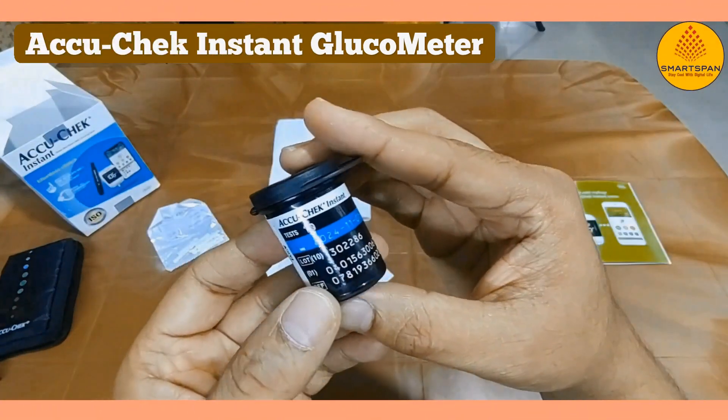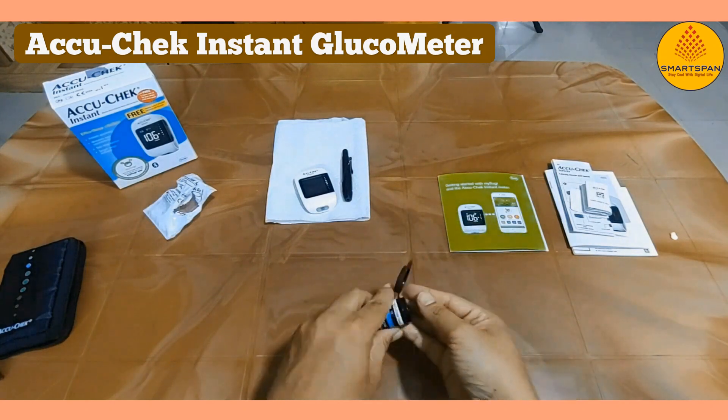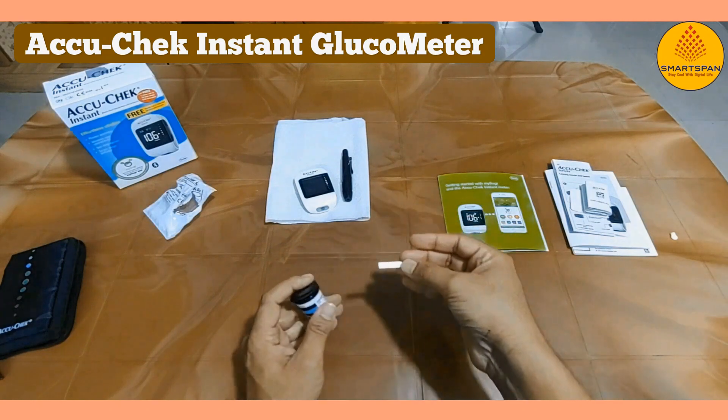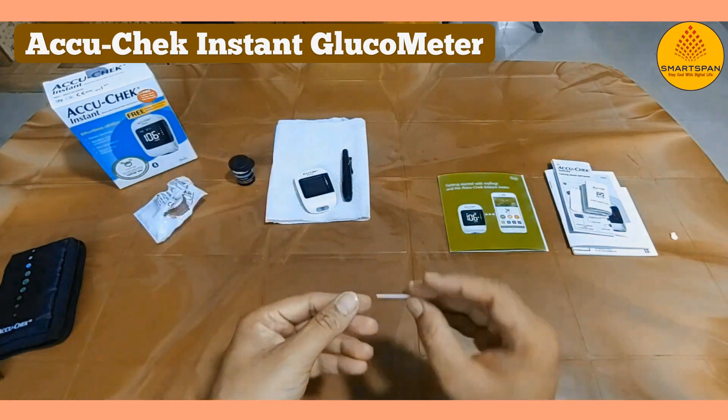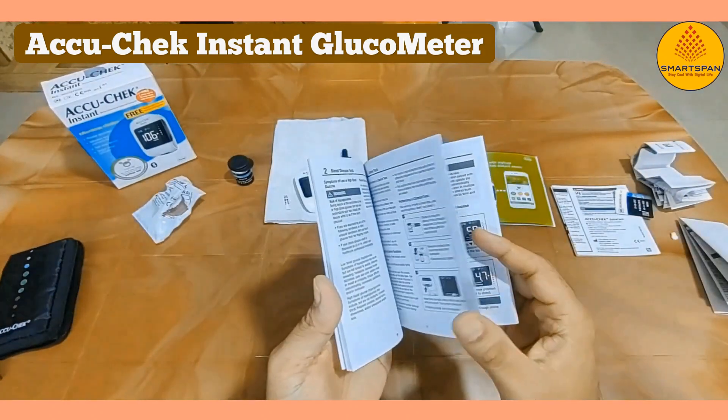Now let's take a closer look at how to prepare the glucometer for use. Before we begin, remember to wash your hands thoroughly to ensure accurate readings. Take one test strip and keep it aside. If required, you can refer to the user manual for better understanding.